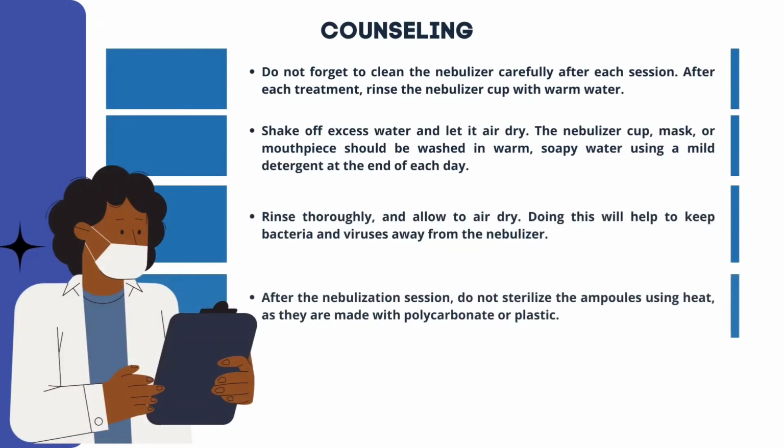Do not forget to clean the nebulizer carefully after each session. After each treatment, rinse the nebulizer cup with warm water. Shake off excess water and let it air dry.